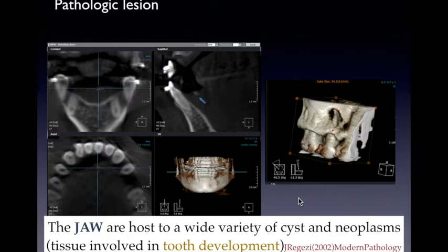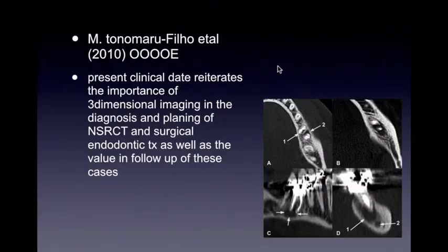assessing osseous structures has become a very important tool in terms of diagnosing and planning for intraosseous lesions, or most of our pathologies. A paper published here shows the value of CBCT in endodontics, wherein because you still have intact buccal and lingual cortices, you cannot see this small starting radiolucency on the mid-buccal region because of a lateral canal.